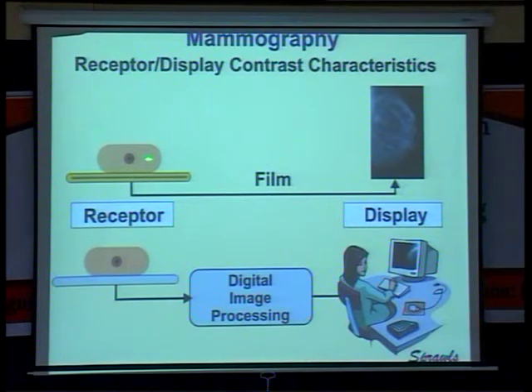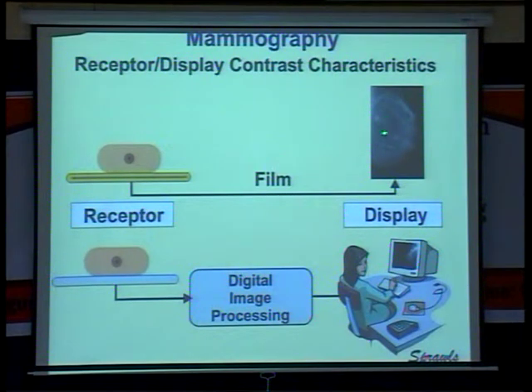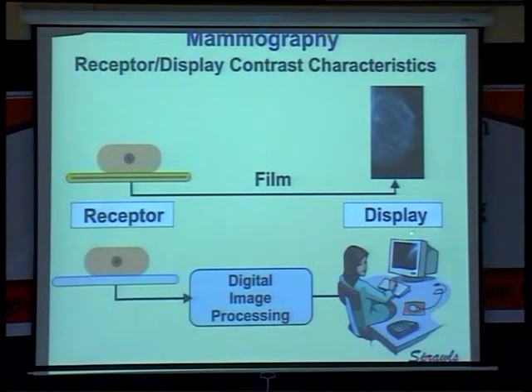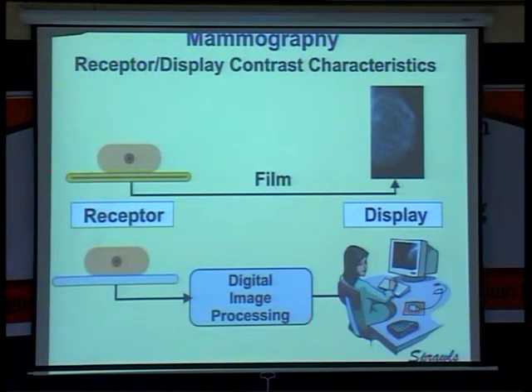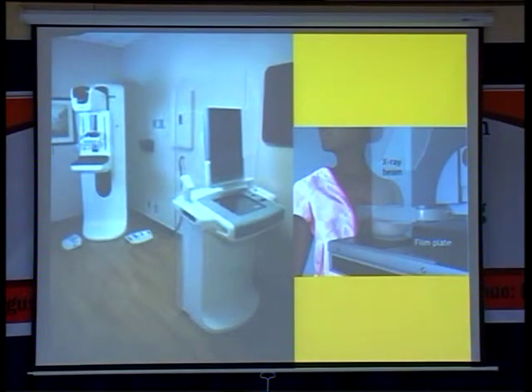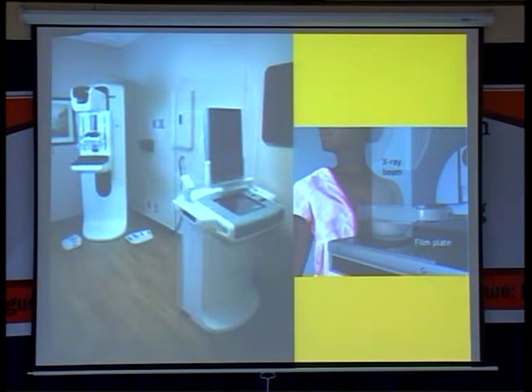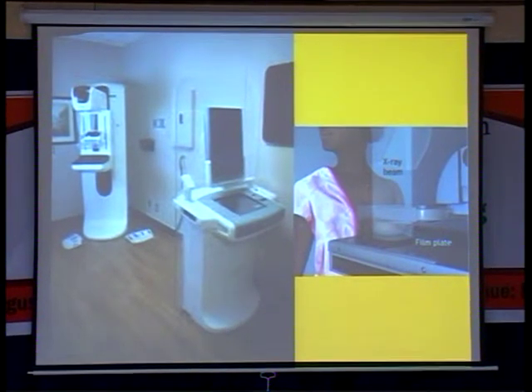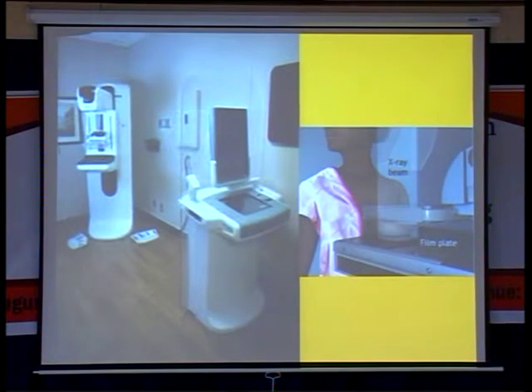This is the breast and the film cassette. This is film mammography. When you push it to the computer, the digital imaging processing and display allow you to modify the brightness, contrast, and magnify for better visualization. This is how the equipment looks — the digital mammography unit. As soon as you take the image, within 3 seconds it will be displayed and you can see the images on the monitor.